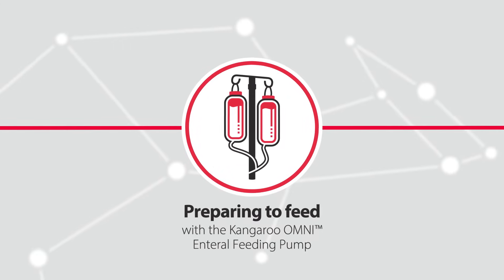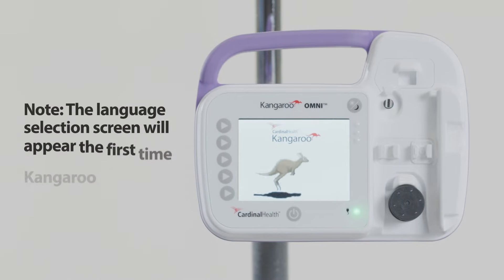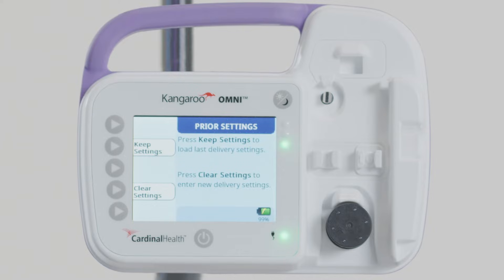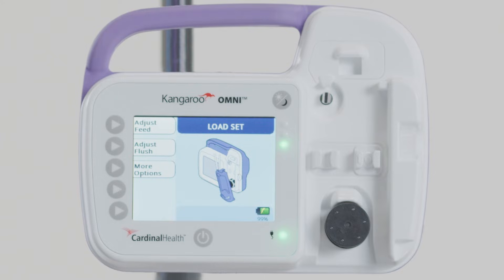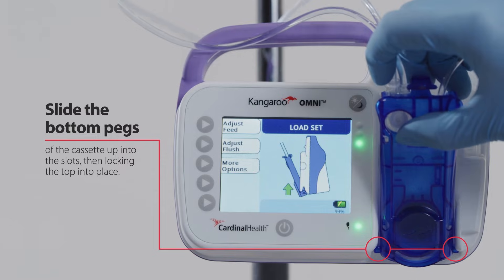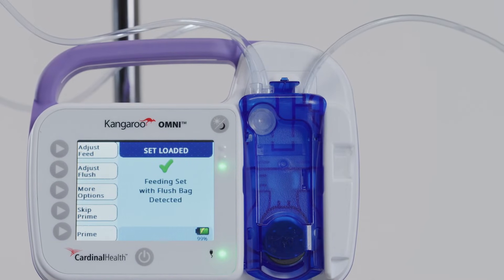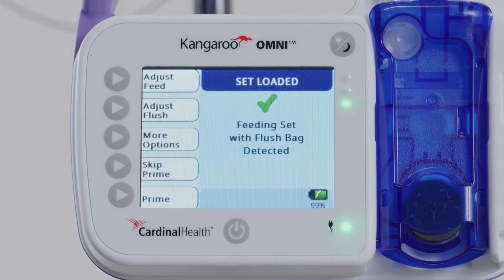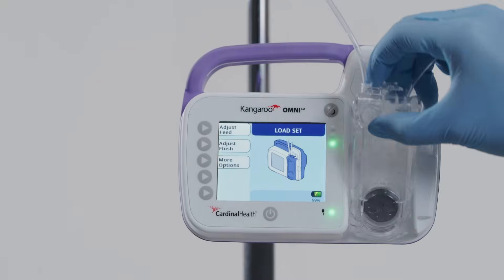Preparing the Kangaroo Omni enteral feeding pump for feeding. Press the power button centered below the pump screen to turn on the pump. The prior settings screen will appear, retaining settings from the pump's previous use. To keep previous settings, press Keep Settings; otherwise, press Clear Settings. From there, you will see the Load Set screen. Follow the animated instructions to load the cassette by sliding the bottom pegs up into the slots, then locking the top into place. You will hear a click when the cassette has been installed correctly, and the Set Loaded screen will confirm the pump has correctly identified the feeding set.